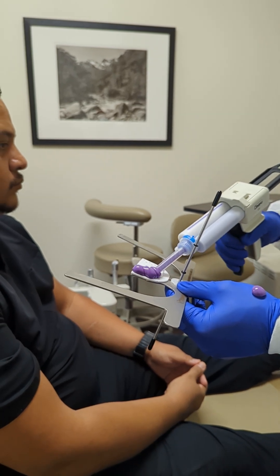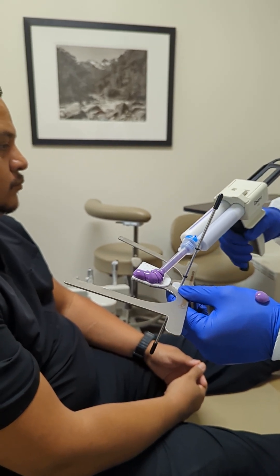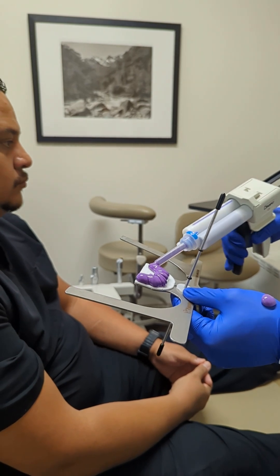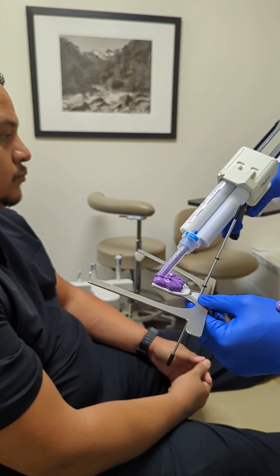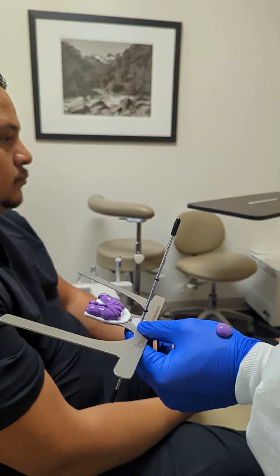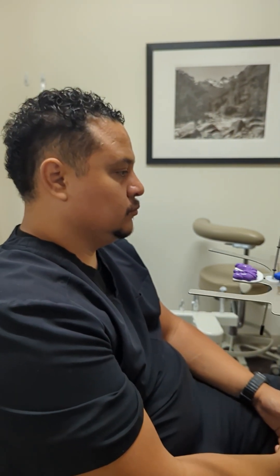Go ahead and bleed a little bit onto your glove, and then you want to pile it up so that it can index the teeth. Make sure you want to have sufficient amounts on the posterior region since the teeth are going to tip up a little bit.